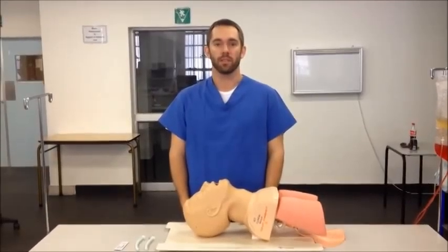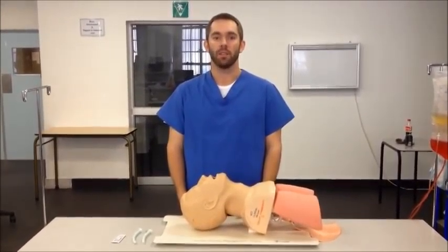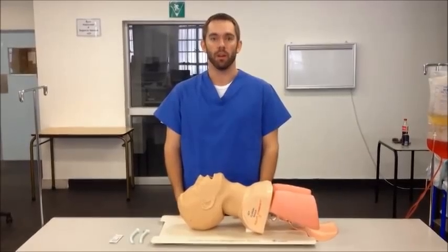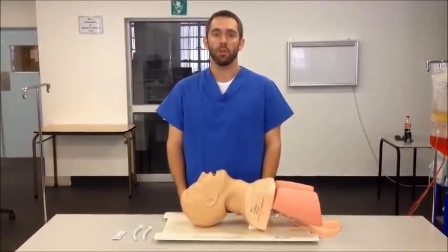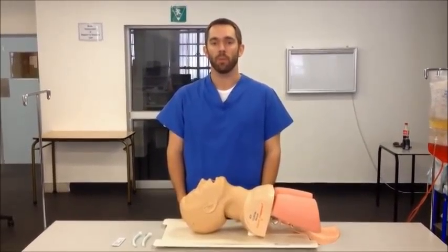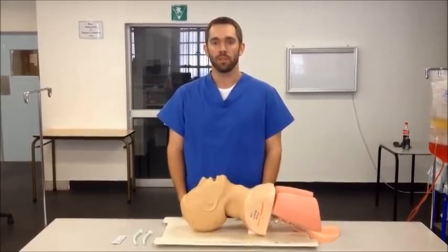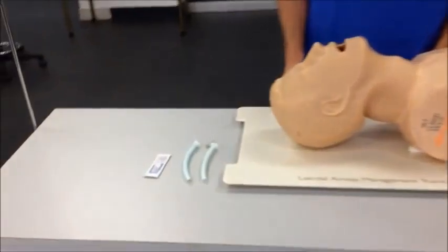Hi, this is Almiro Oosthuizen with Cape Town Emergency Medicine, here today to talk about correct insertion of a nasopharyngeal airway. A nasopharyngeal airway is an airway adjunct device used to manage airway obstruction caused by collapse or sagging of upper airway soft tissue. The first step in insertion of a nasopharyngeal airway is to select the correct size.